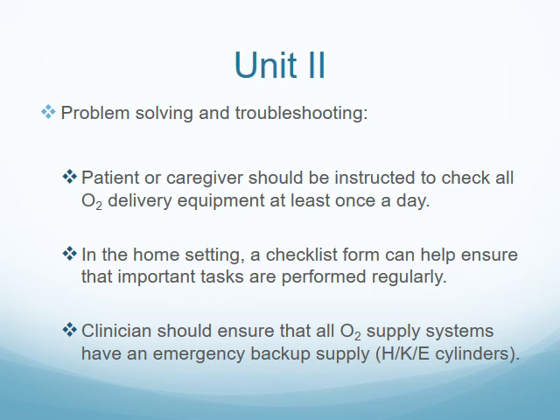They have their own protocols and routines that they follow. But you always want to have some kind of reference sheet to give to the patient or family member, because they forget how to do things, just so they can kind of go back and check. Clinicians should ensure that all O2 supply systems have an emergency backup supply, either H tank, K tank, or E cylinders, as stated previously.